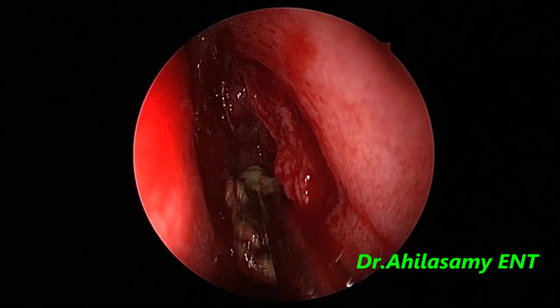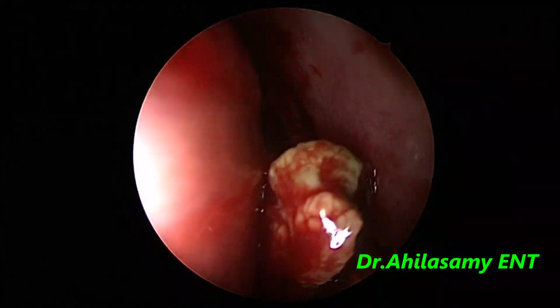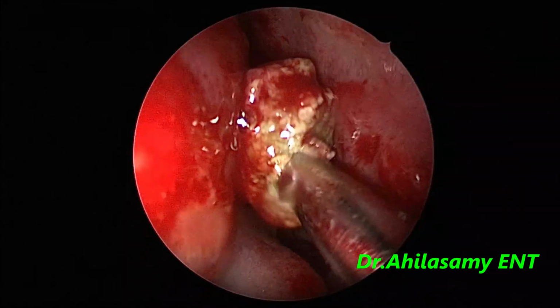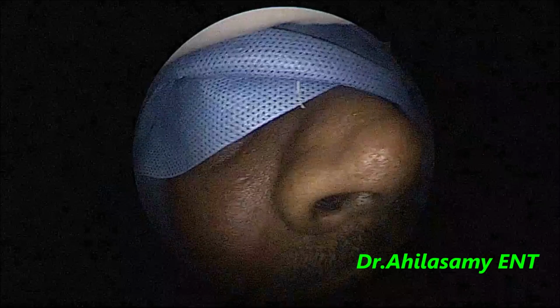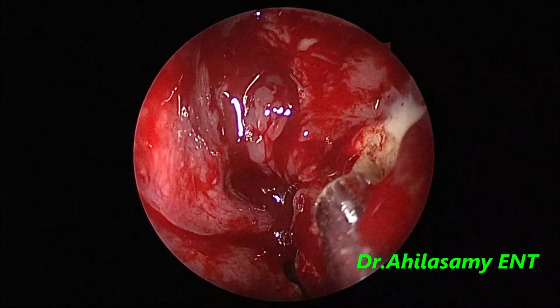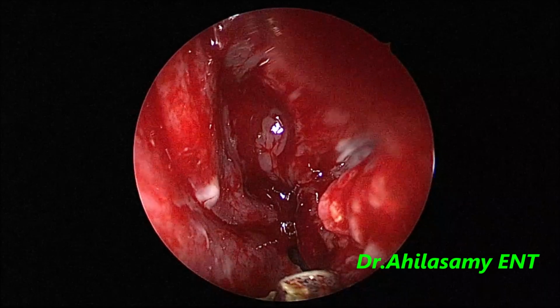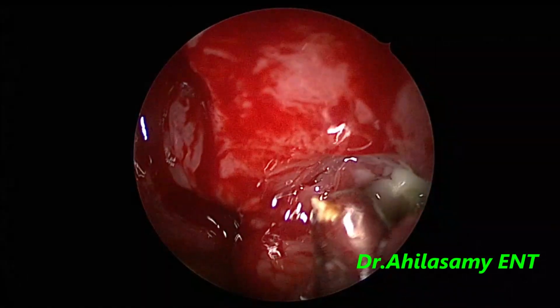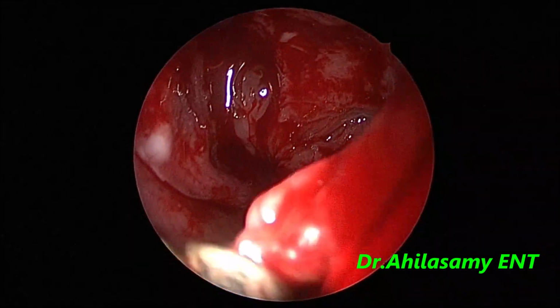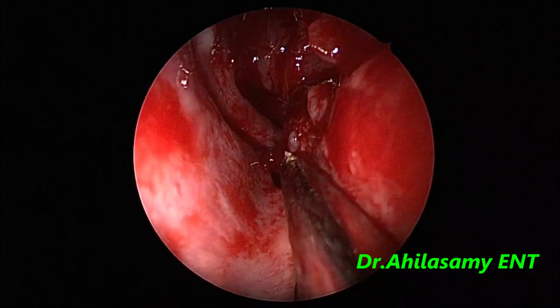This fungal material will be taken out and sent for histopathological and microbiological analysis like staining and fungal culture. Keep sucking, never allow the blood to trickle down. See, the maxillary sinus fungus has melted because of the itraconazole and prednisolone given preoperatively, so it is very suckable like butter. These edematous tissues are being shaved off.